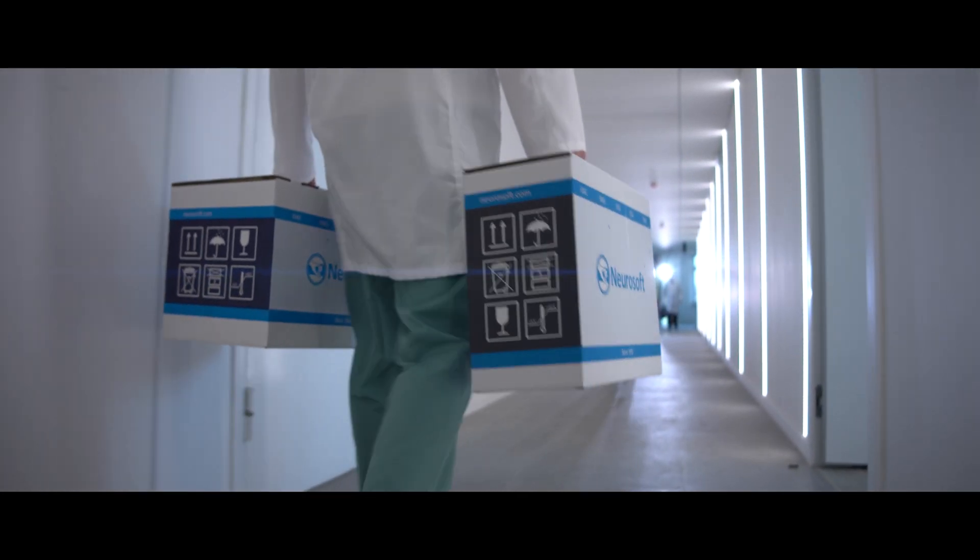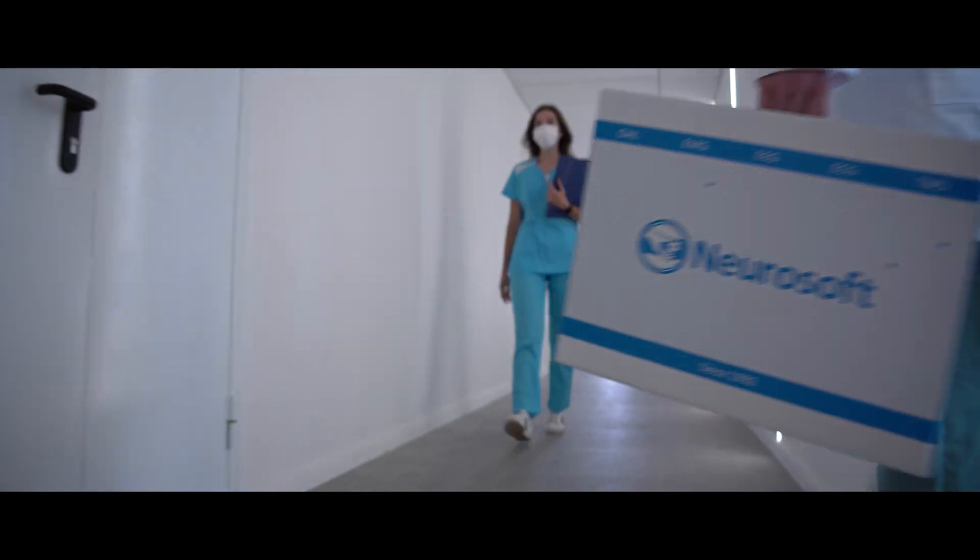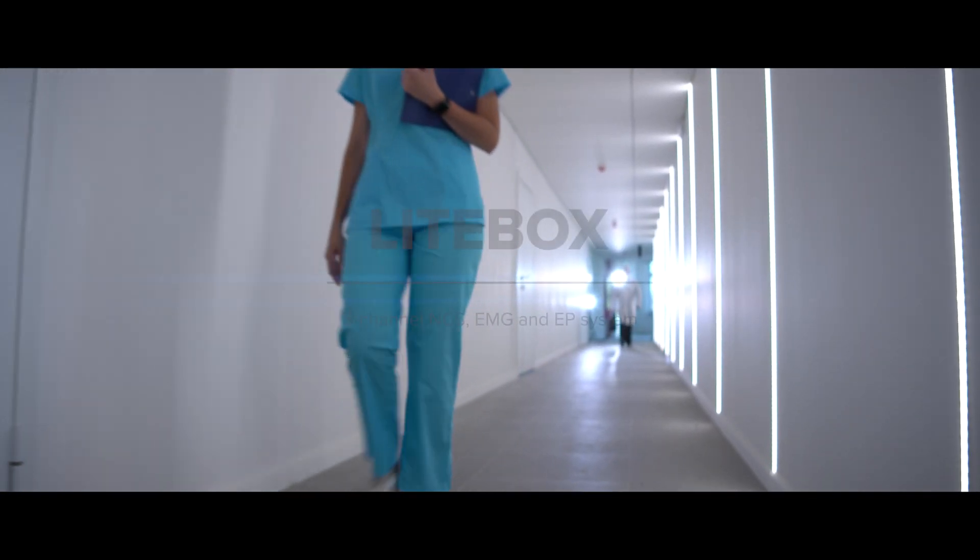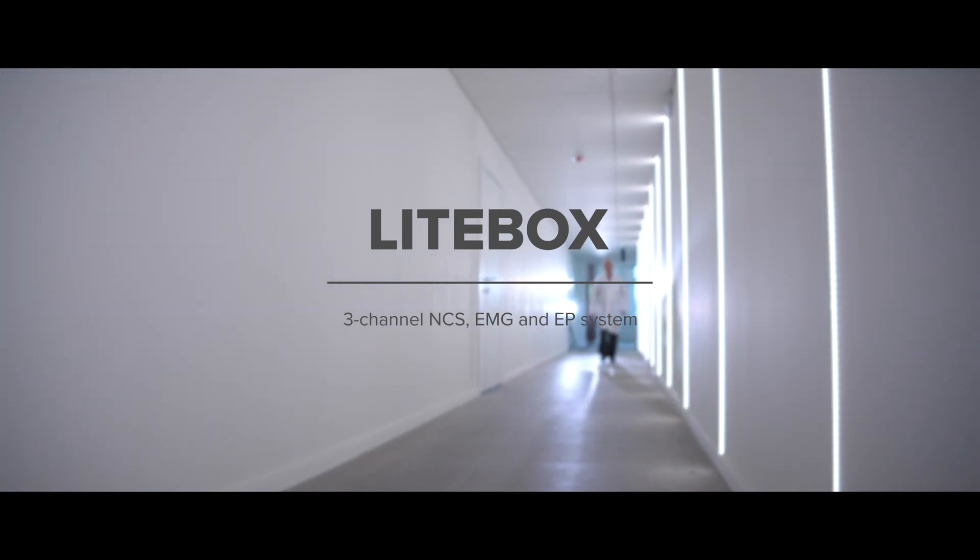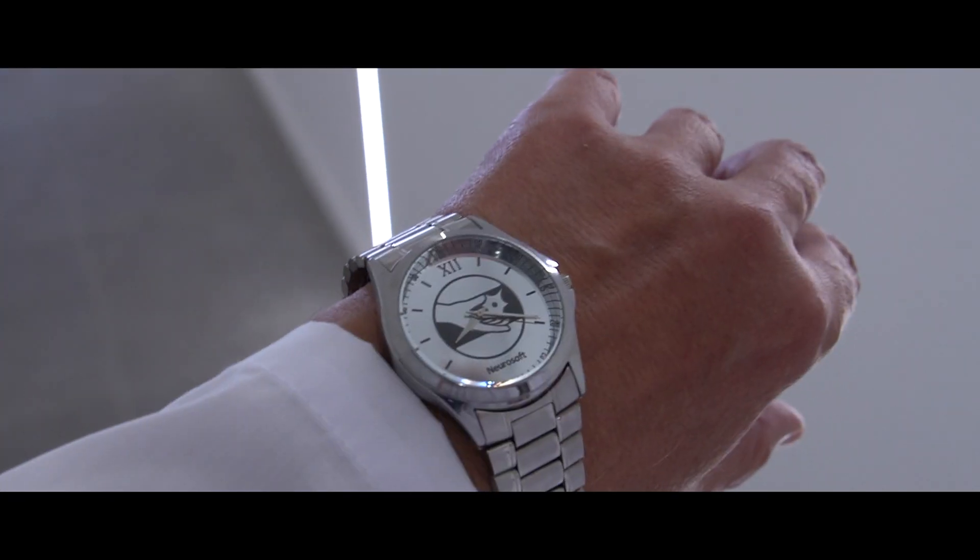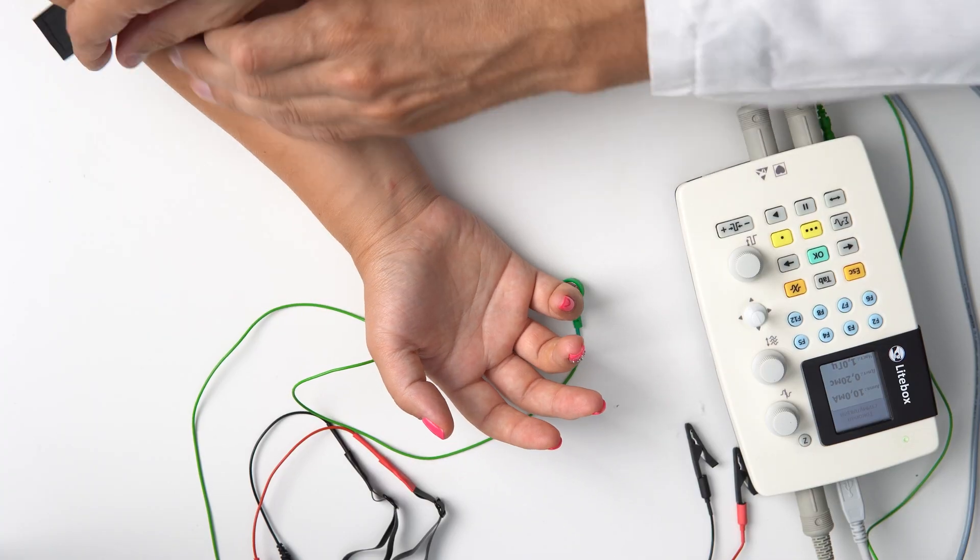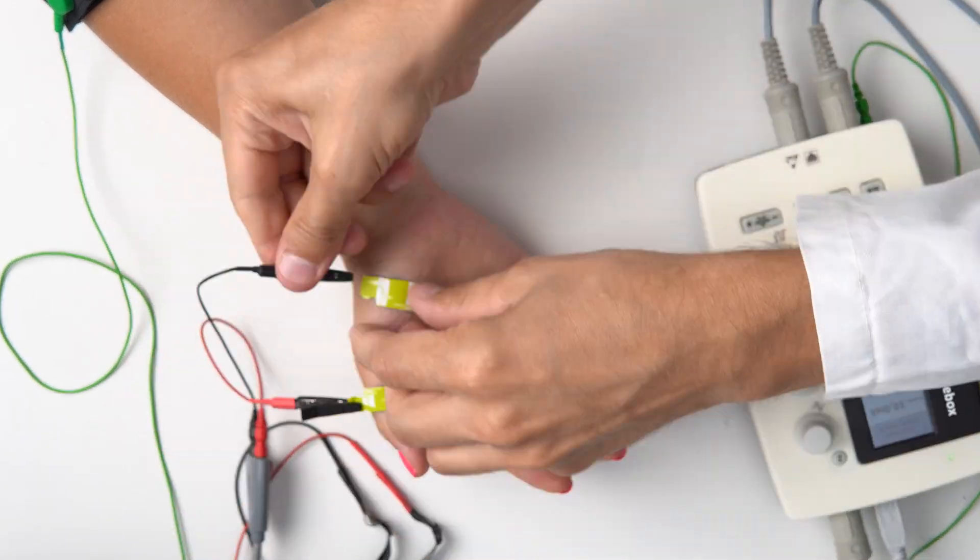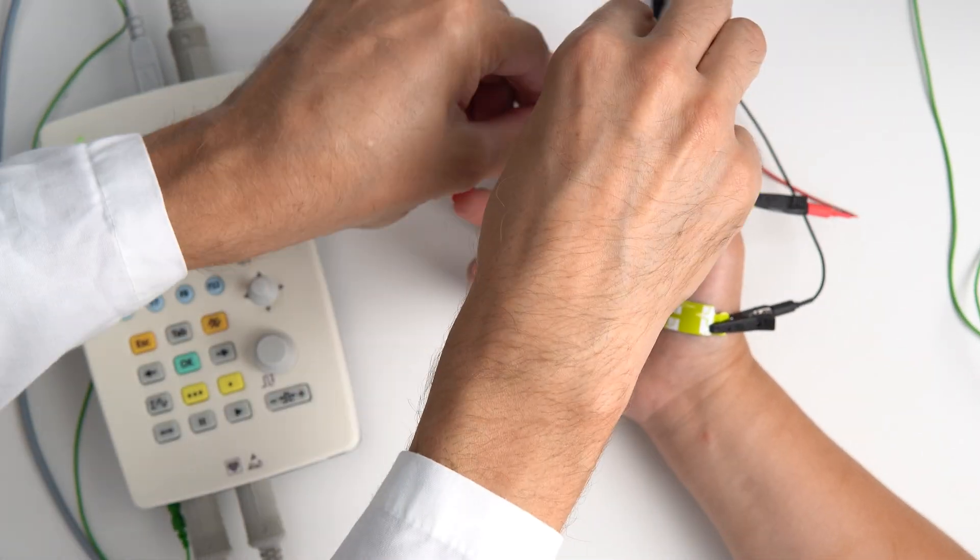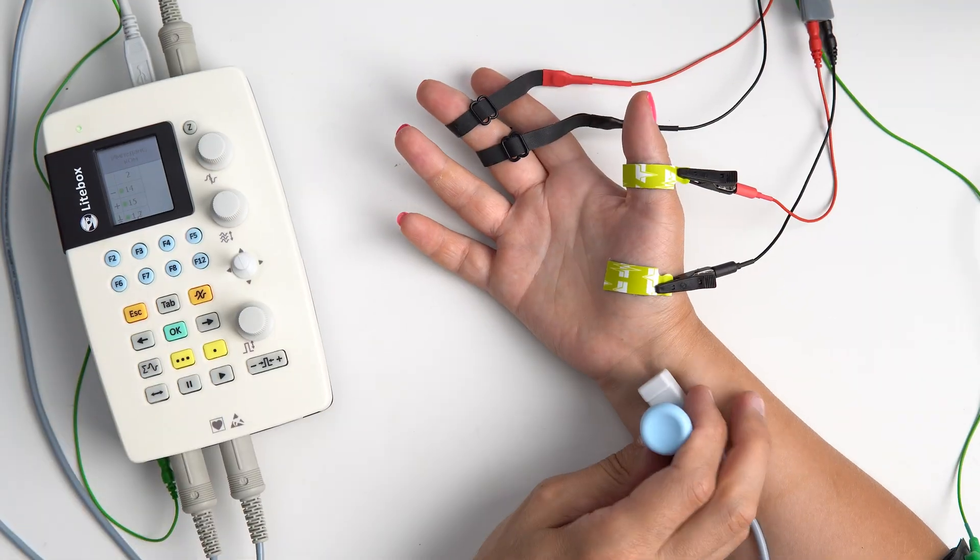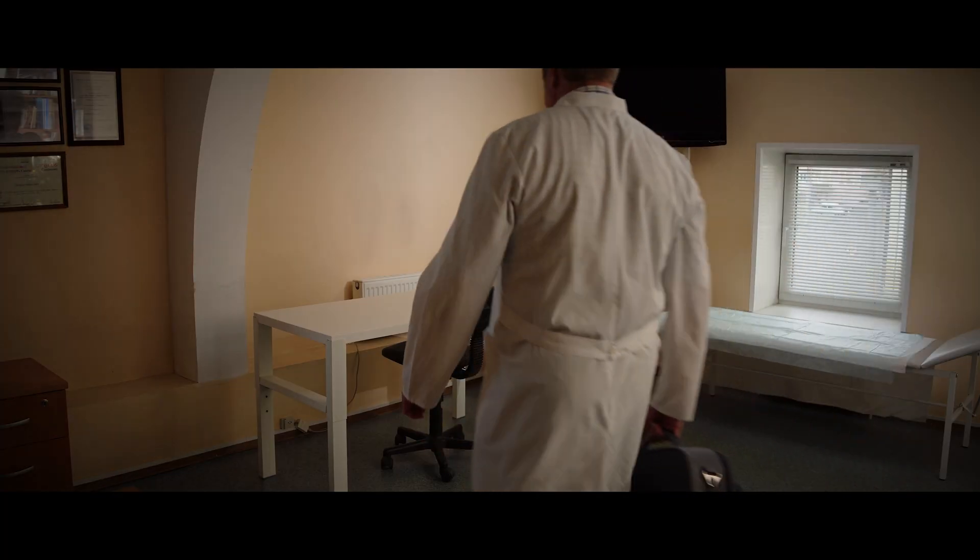Electromyography is one of the most informative methods of objective diagnostics when it's about neuromuscular system disorders. Various EMG techniques help not only diagnose, but determine the severity and nature of the condition.